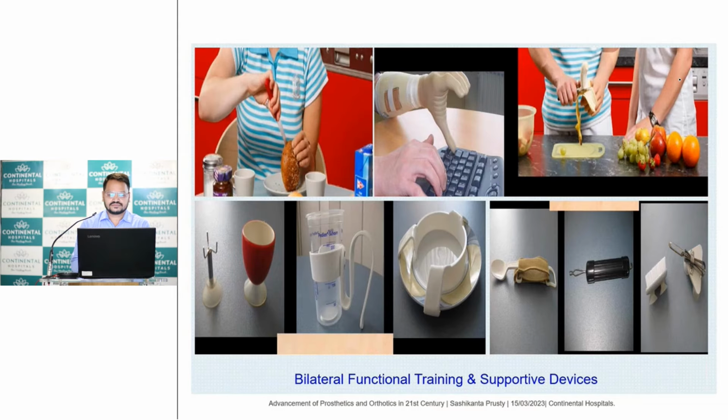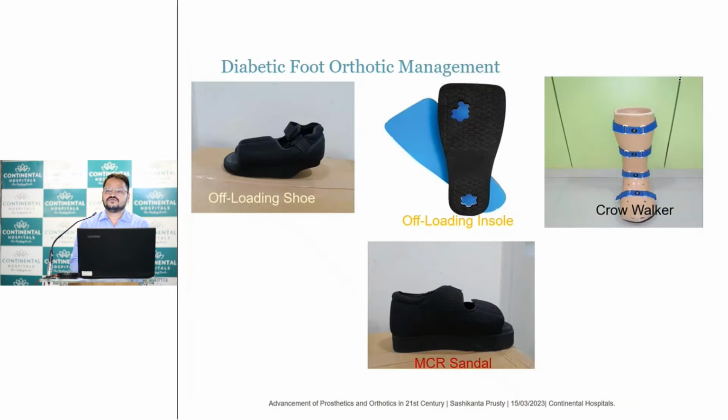So these are some of the functional specific designs that we normally do when they can do some fine motor activities. Now coming to foot orthotic management, particularly diabetic foot, it's a very vast topic, it can be a topic by itself. We have specialized baropodogram studies that we take. We do posture analysis, and we do specific temperature analysis. Then we see which areas have very high pressure, and that will show us in percentage manner. Then as per that we take a call on which area is to be offloaded, which area we can give some pressure, and how it is helping.